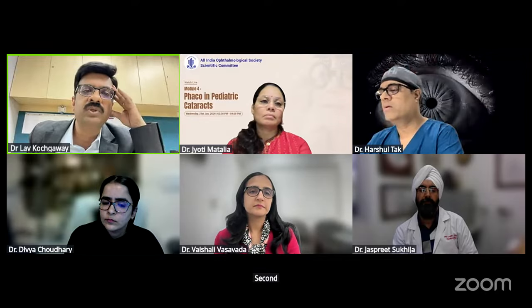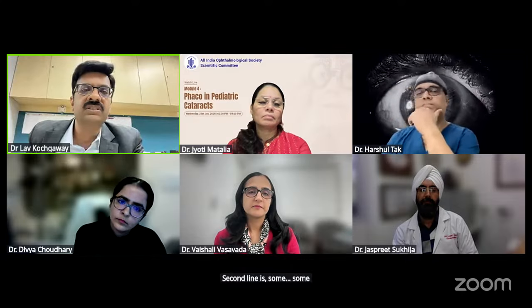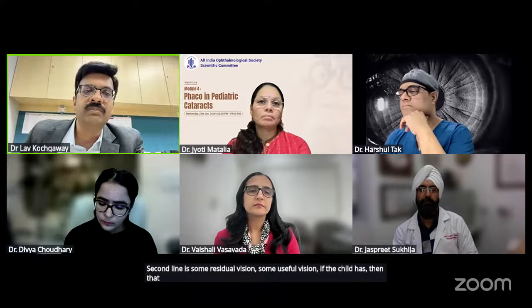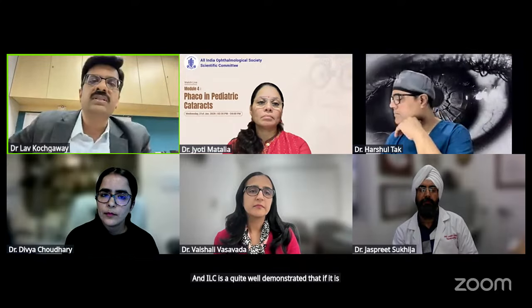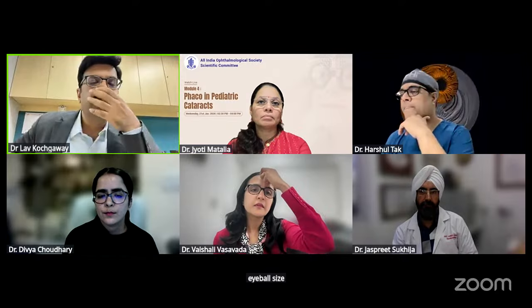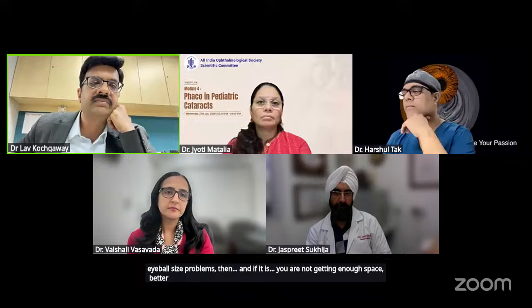That is the first line. Second line is some residual vision, some useful vision. If the child has that, then that eye acts as a stepney. And for IOL, she has quite well demonstrated that if it is associated with eyeball size problems, and you are not getting enough space, it is better to leave them aphakic.